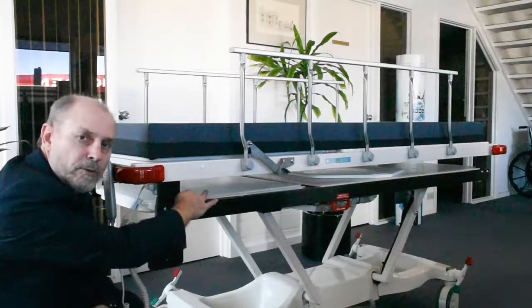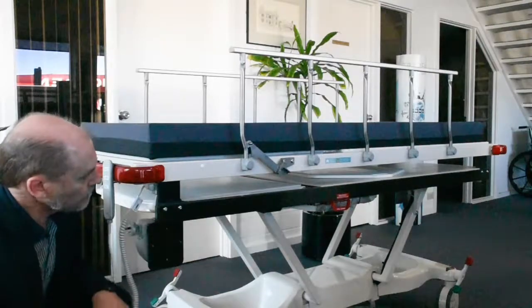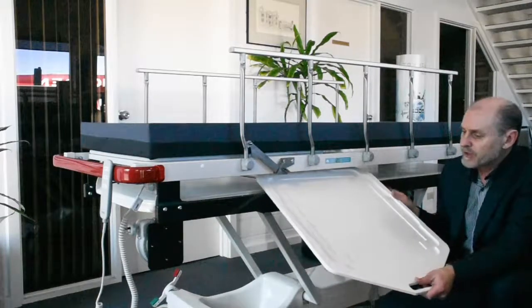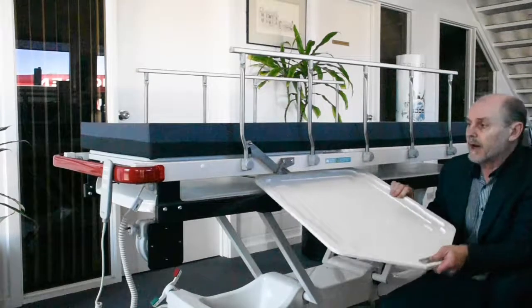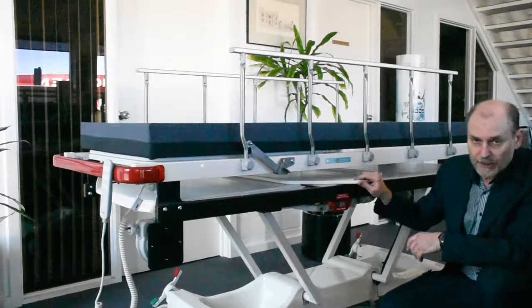The x-ray film or digital cassette is placed on the sub-table here. There is a digital cassette holder that ModCell provides. This can be tailored to fit any brand of digital cassette and makes the placement of the cassette a lot easier.